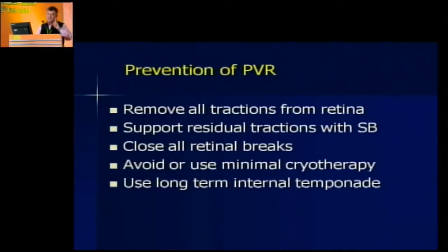So for recurrent RD, remove all the traction from the retina before. Support the residual traction with a scleral buckle. I think Dr. Raman mentioned that. Inferiorly, many a time, you are not able to remove it. You have a contracted retina, put a buckle. You will be much safer later on. And close all retinal breaks. So don't leave anything. And use minimum cryo. And the use of long-term tamponade is very, very important.